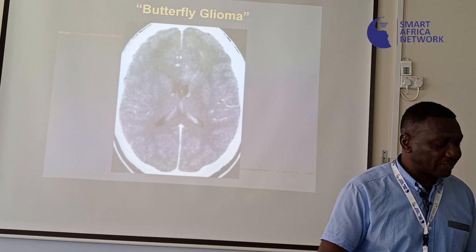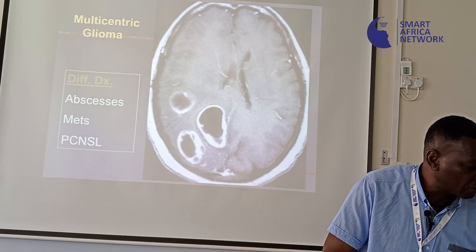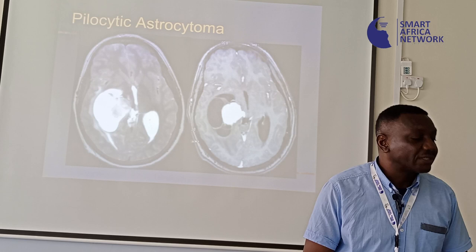Okay? The other thing you need to do, okay, let me leave this one. I'm going to talk about this. I talked about the ability to use contrast and things like that. Okay? So different sequences help us to look at images. All right?